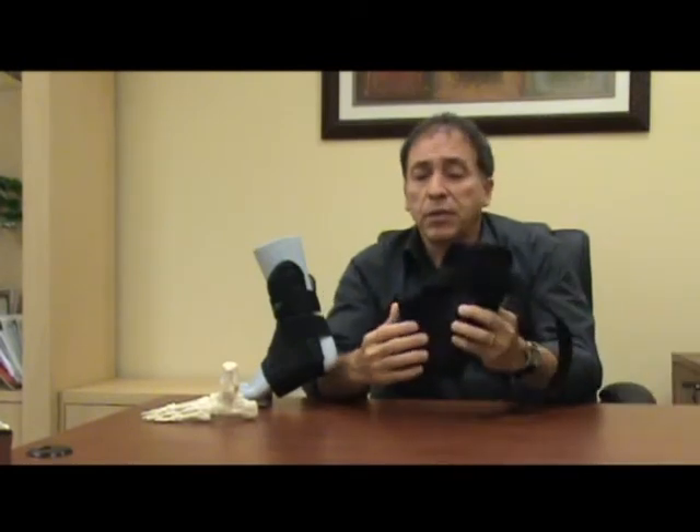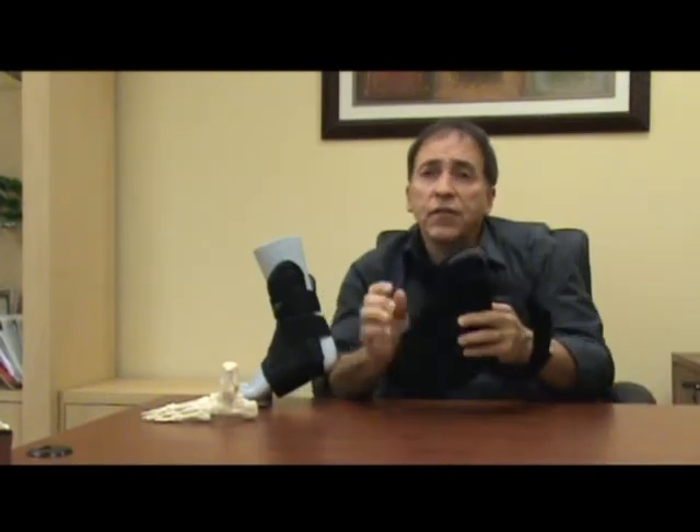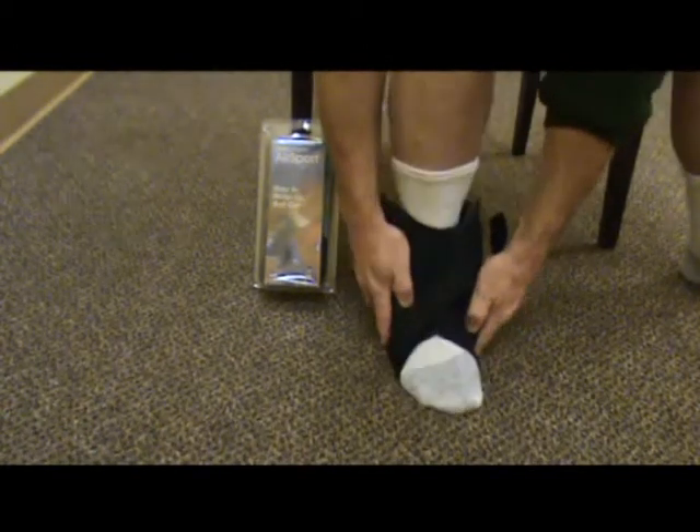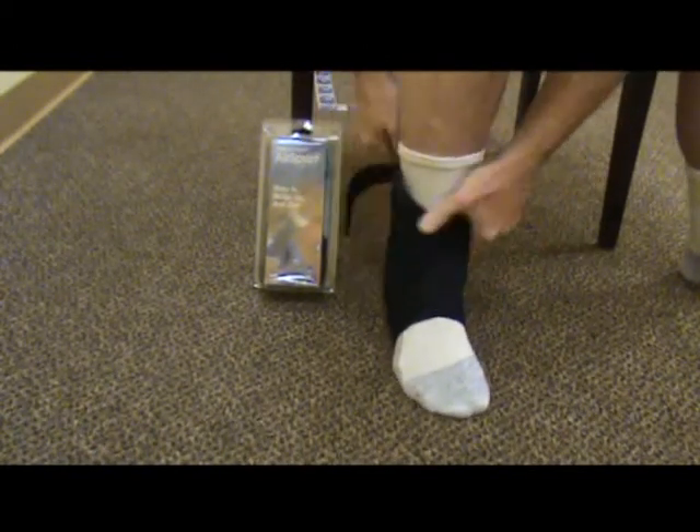One of the most unique features of the brace is this step-in design. As you can see from the video, the brace slides on easily over the patient's foot and comes to rest directly on each side of the ankle.